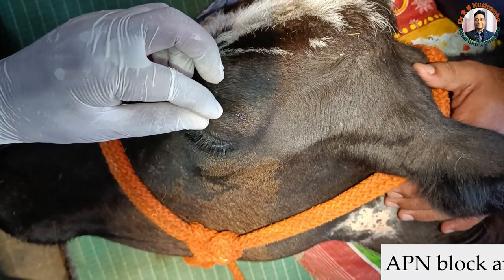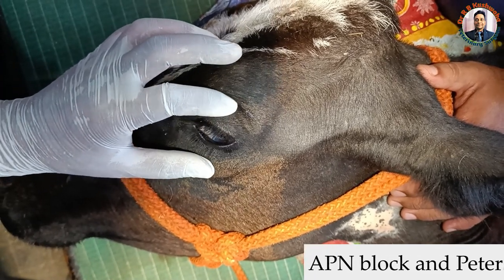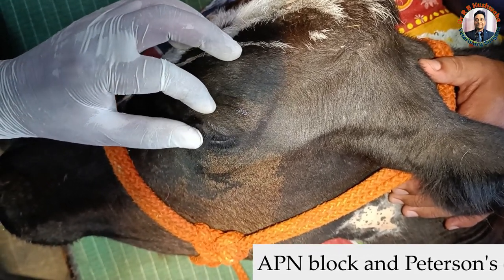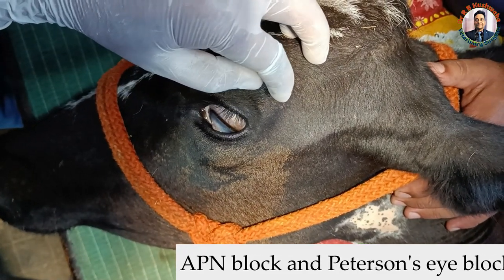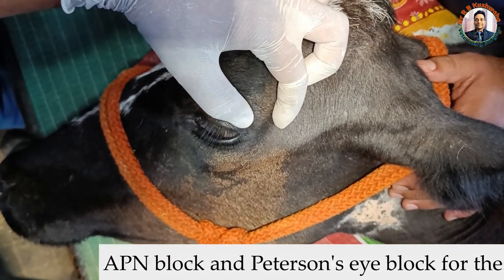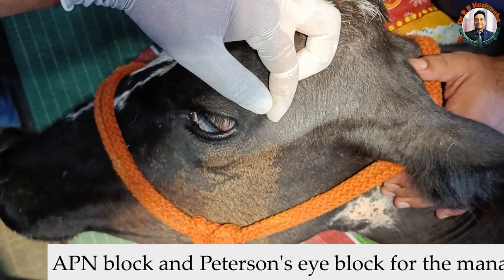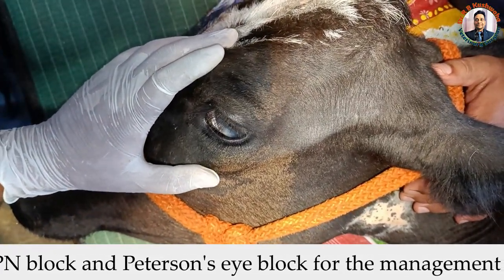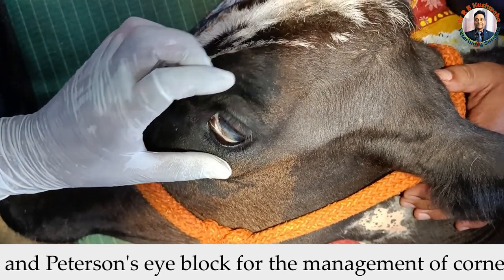Once you block this nerve, there will be no movement of the eyelids — upper eyelid as well as lower eyelid — meaning akinesia of the eyelid. The Peterson nerve block means we inject local anesthetic solution behind the eyeball, targeting different branches of the trigeminal nerve which emerge from the foramen rotundum and supply the eyeball.